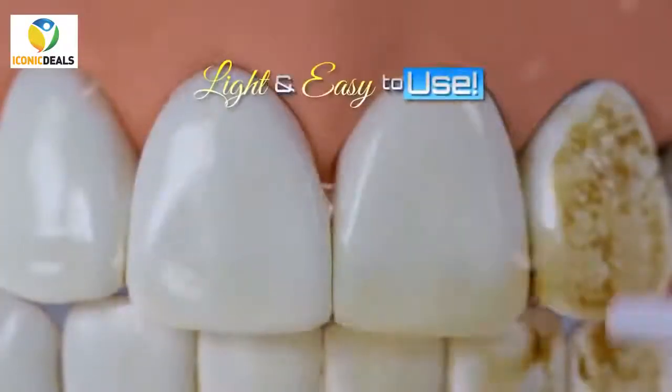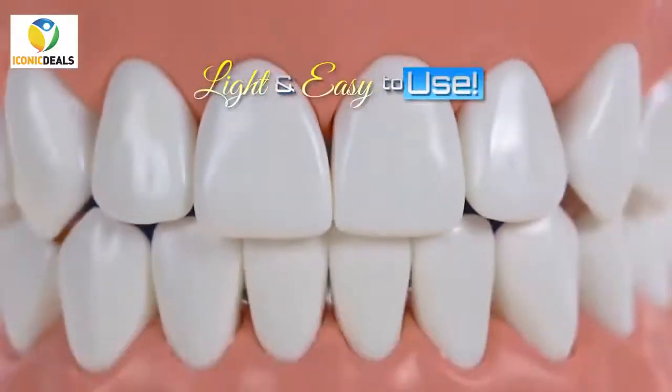The Power Floss is amazing. It's very light, very easy to use. You just put the water in the reservoir.